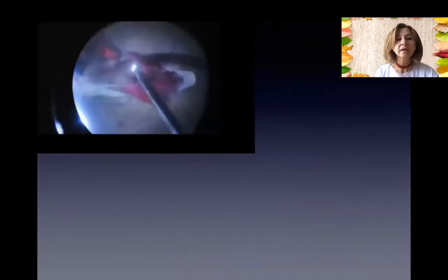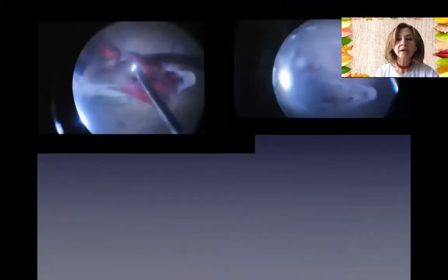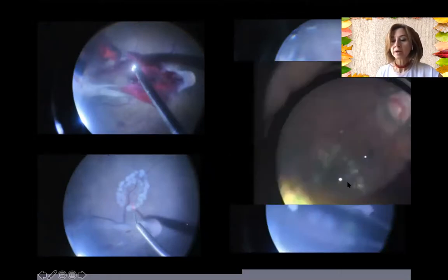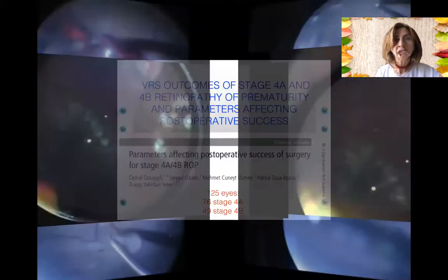So this was a stage 4B case. We removed the membranes and the subhyaloid hemorrhage, but while doing that posterior hyaloid removal, we ended up with a very small retinal break, which is not in the most proliferated area. Then we did laser, gave only gas, and as you see here, the retina was attached nicely.